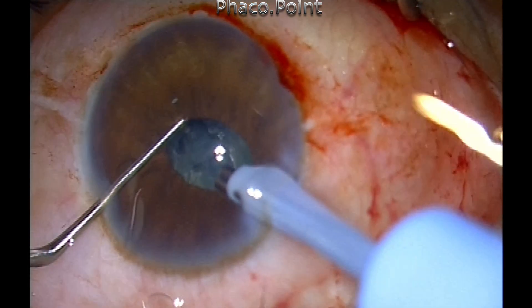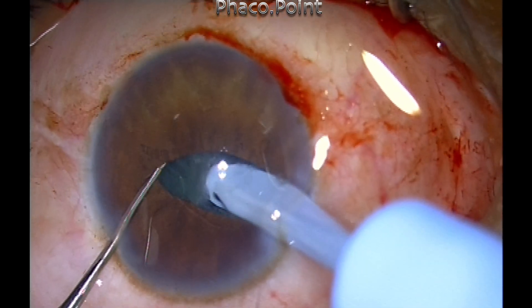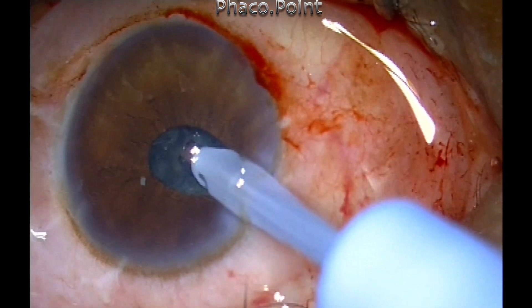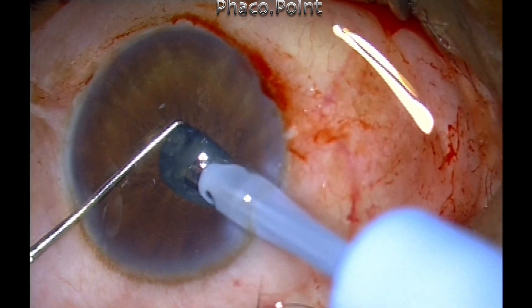When you have cracked the nucleus down into at least four to five pieces, it is wise to bring out the sharp chopper and replace it with a Sinski hook, which is more forgiving within the eye. You don't want to nick the edge of the capsular rhexis during emulsification.